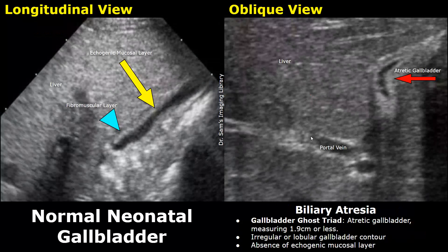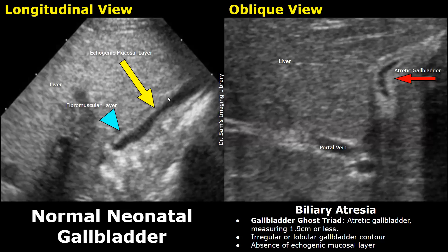Another sign of biliary atresia is the gallbladder ghost triad. It refers to a small atreticgallbladder measuring 1.9 centimeters or less in a neonate. The normal gallbladder will have a distinct echogenic mucosal layer and a fibromuscular layer — this is the normal appearance of the gallbladder in a newborn.